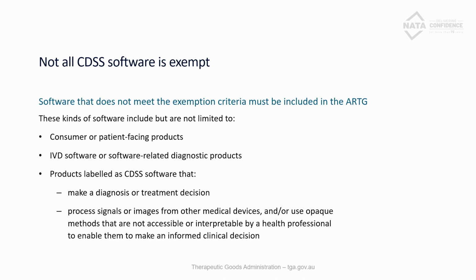And we recently undertook a consultation about this particular exemption just to clarify some of those requirements and really make it clear that software that's consumer-facing is not an exempt CDSS. It doesn't include IVD software as inputs, and even if it's labelled as CDSS, it doesn't necessarily mean that it's exempt. It still has to comply with those requirements.